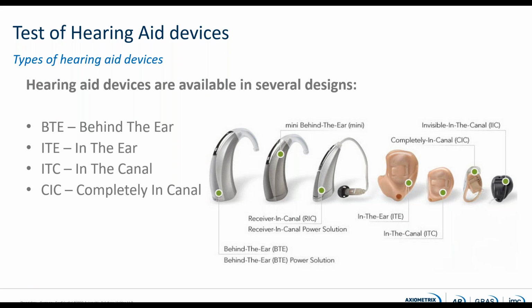Different types of hearing aids. I'm quite sure that you are very familiar with the different types of hearing aids, but today what we are going to talk about are the hearing aids behind the ear, in the ear canal, and completely in the ear canal.